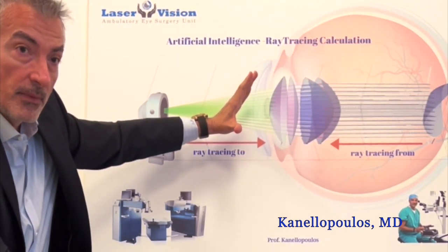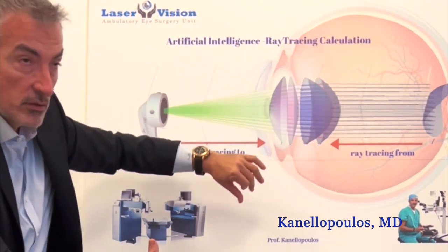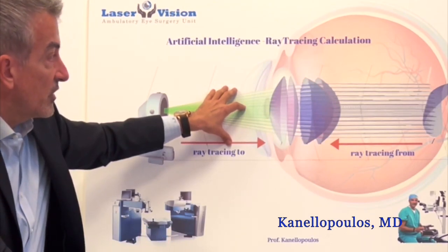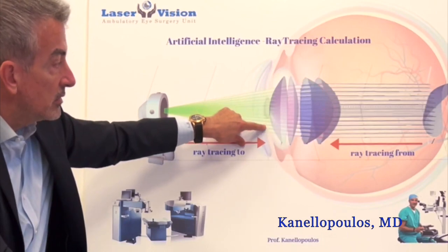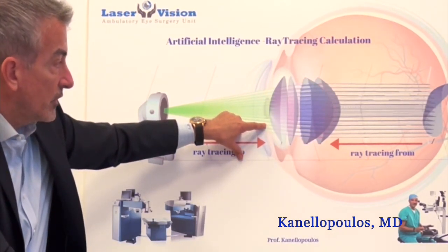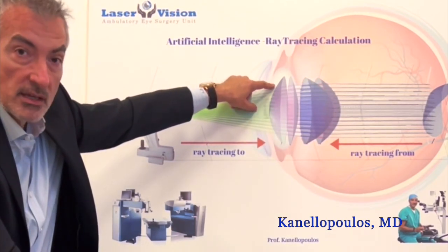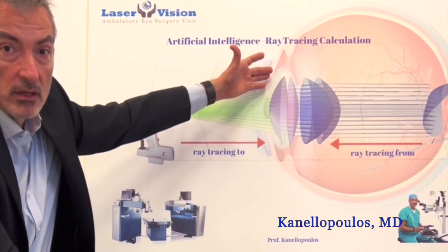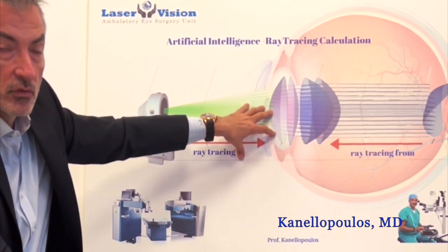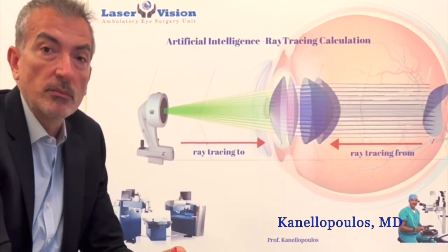So its correction to that tilted cornea in relation to the rest of the eye as a visual system, as a refractive system, is that it treats very little at the peak of the cone, which is the steepest part of the cornea, and more away from the mid-periphery of the cornea as a hyperopic arc where the cornea is usually thick, thus obtaining remarkable normalization of the cornea with very little treatment over the thinnest part of the cornea, which is the peak of the cone.